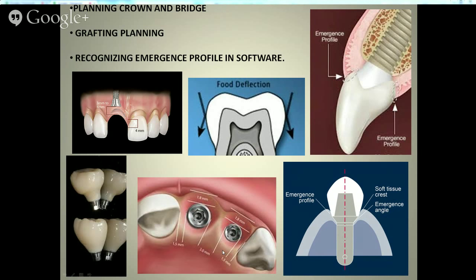The picture in the bottom middle just gives us guidelines that I think we all know about at this point. The parameters of the implant between the natural tooth, the parameter of inter-implant distance, implant to implant, of 3 millimeters, and the ideal amount of thickness we need between the facial of the implant and the gingiva itself to create a sulcus that allows us to contour crowns in a natural fashion.